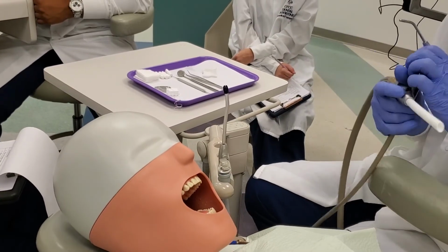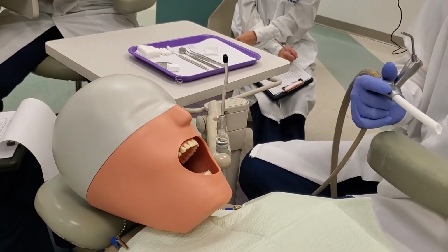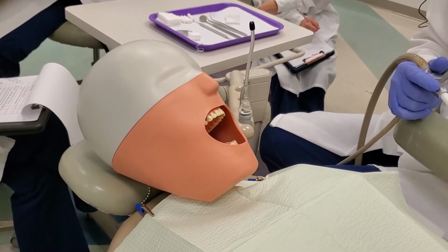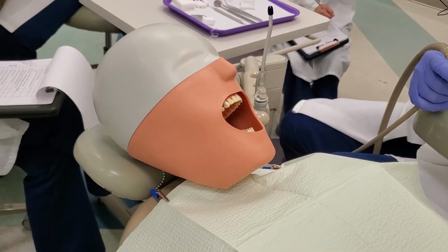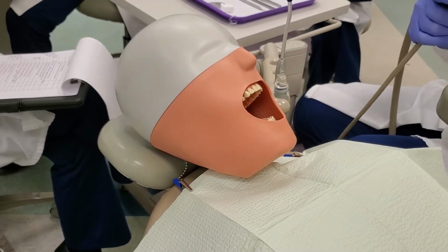Now, honestly, I don't know where the water is going on him. But when you're working on a real person, and you will be for your assessment, I'm also going to be keeping track of making sure that there's no pooling water in the back of your patient's throat. You need to be keeping that in mind too.